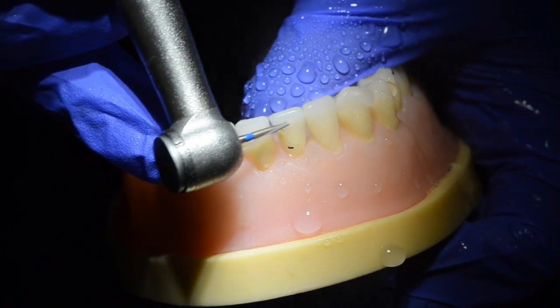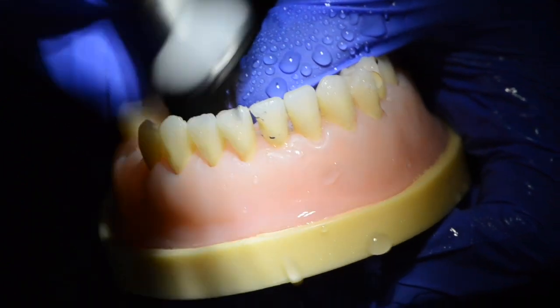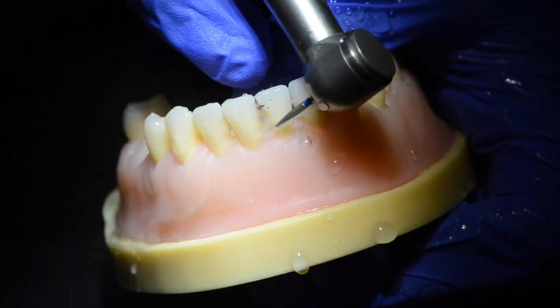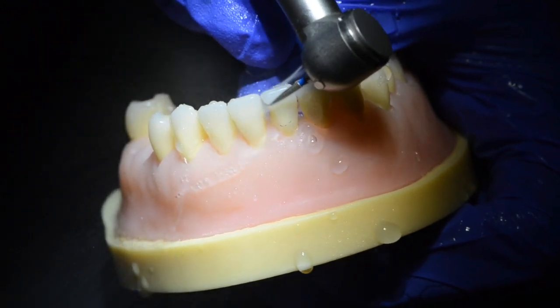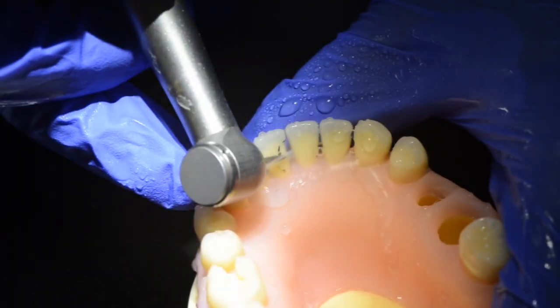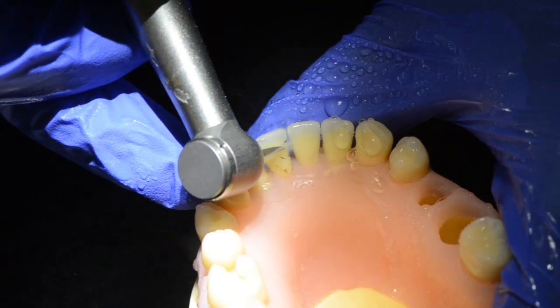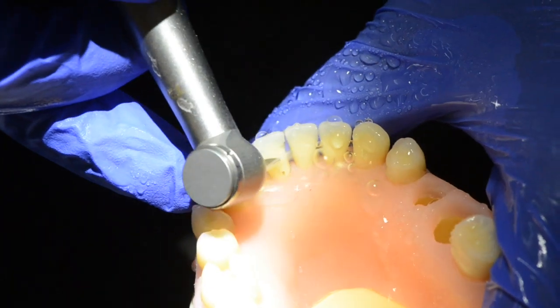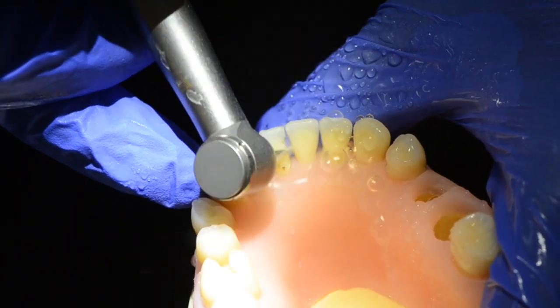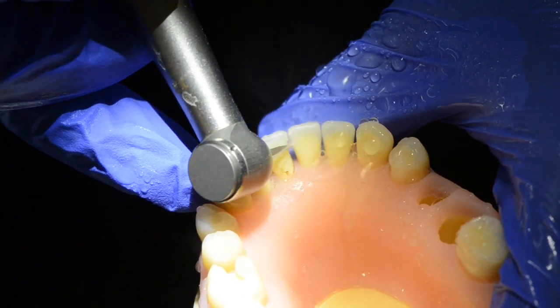I know some of you may be raising your eyebrows, scratching your heads, and thinking that's a lot of destruction — whatever happened to minimally invasive dentistry? But a bevel of this magnitude serves to increase the surface area of your restoration greatly, which will in turn promote longevity of your composite restoration. Another huge plus is that this kind of preparation allows you to truly mask the cavity margins.